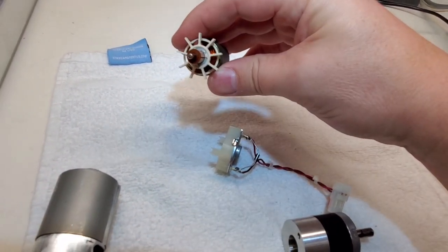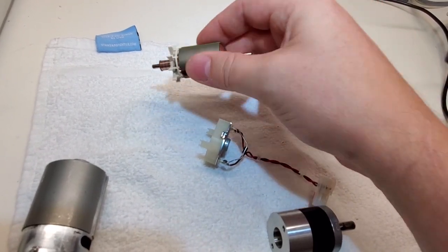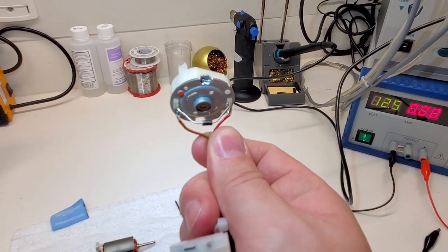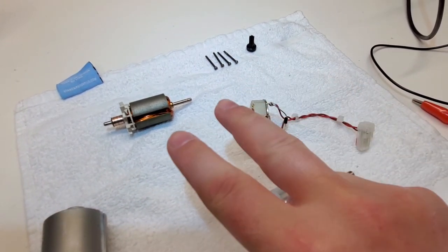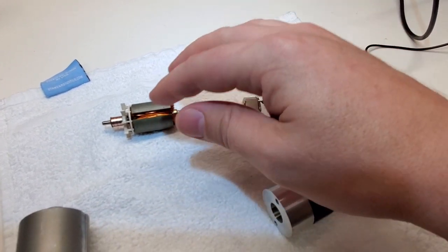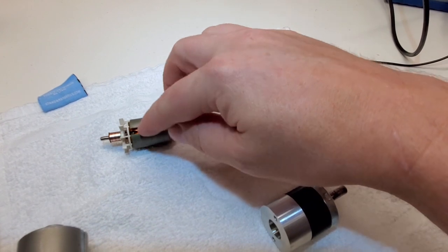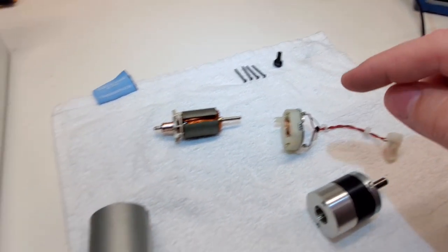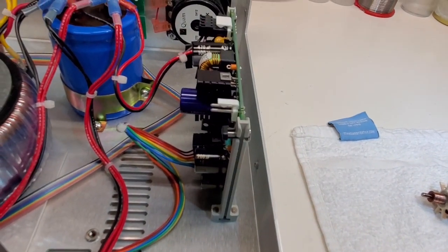But whenever you see fan blades like this that are straight, that normally indicates that it can spin bidirectionally. The reason that this one cannot spin bidirectionally is because of that diode. And what that diode's there for is when you energize the motor and then you suddenly de-energize it, there's going to be a spike in current, because that's what happens when you de-energize a coil. So whenever you de-energize one of these coils, there's going to be a spike which would backfeed into your other electronics. And that's a huge no-no.